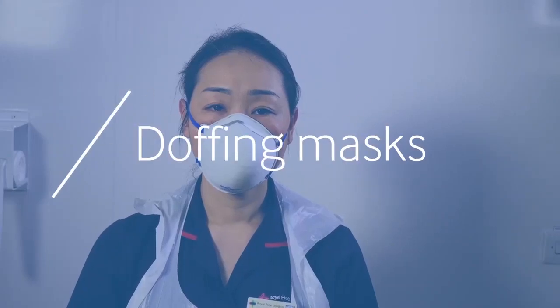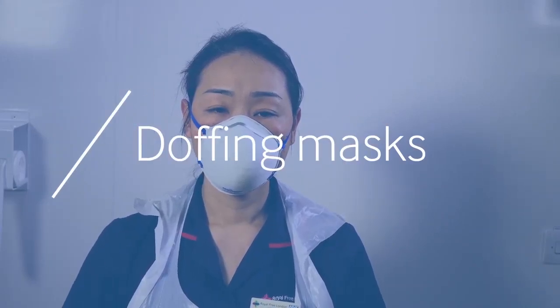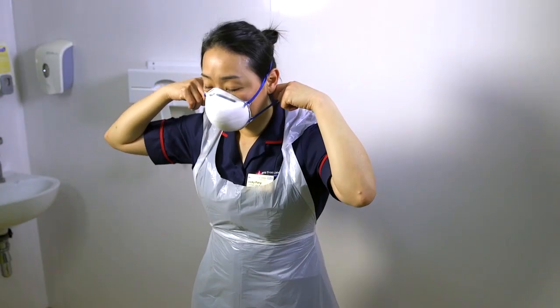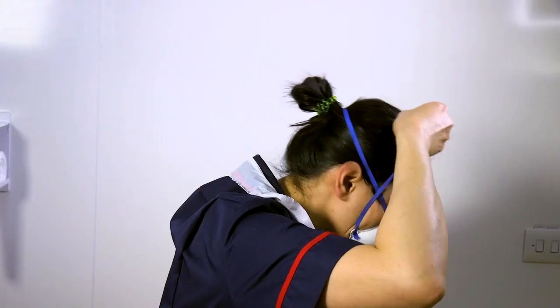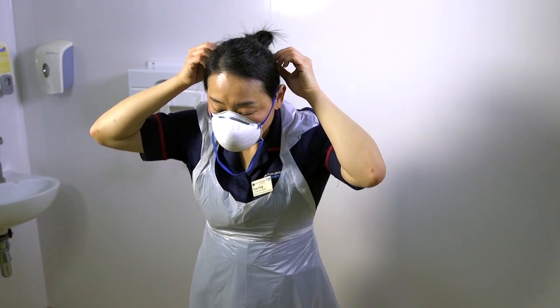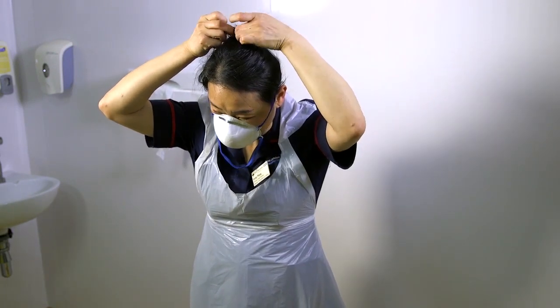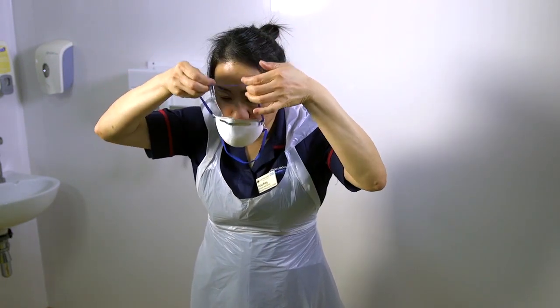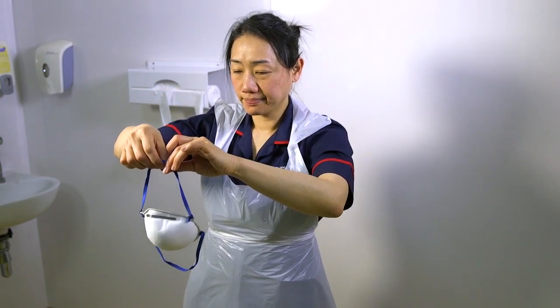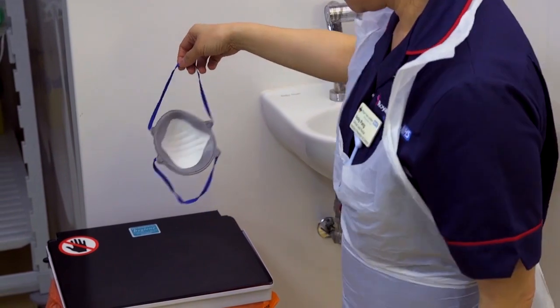To remove the mask, do not hold the front surface — hold the mask by the strings at the side. Tip the head forward. Remove the bottom string over the top of the head, and then remove the top string, maintaining a tension to control the mask's release forwards and away from the clothing. Discard the mask into the bin.